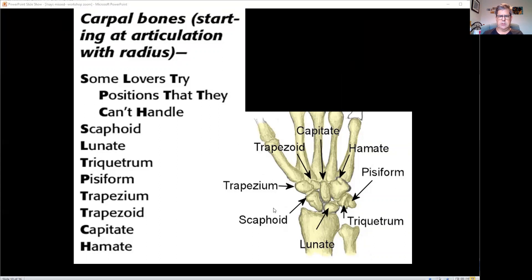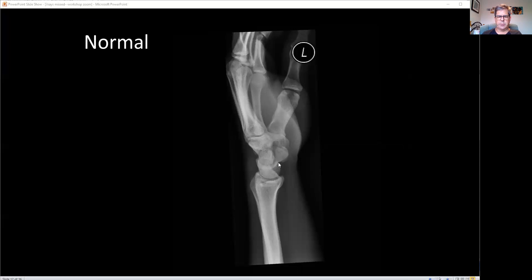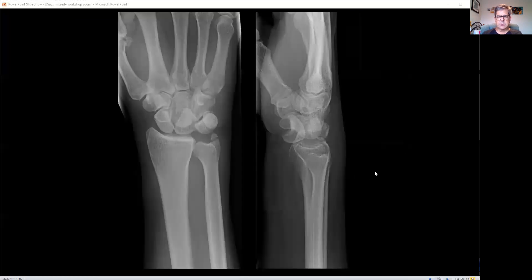There are eight carpal bones. A mnemonic: Some Lovers Try Positions That They Can't Handle. These are normal carpal bones — delineated in two separate rows. That's a scaphoid view and there's your lunate on the lateral, sitting proud. Going back to that x-ray: this is the crowded carpus, and on the lateral the lunate has gone off. There's the scaphoid there, dropped down a bit. So the lunate is dislocated.